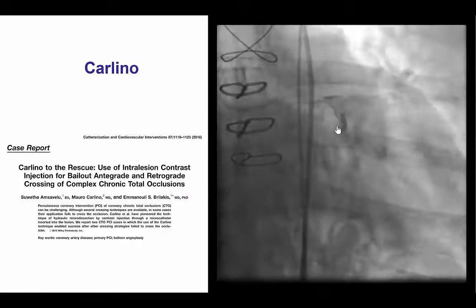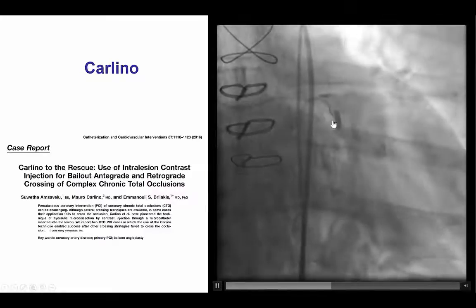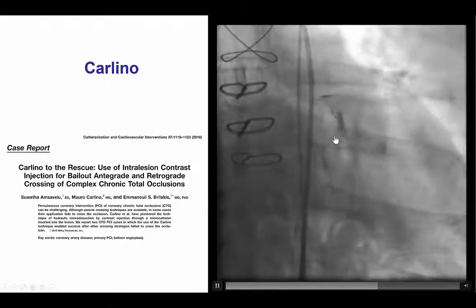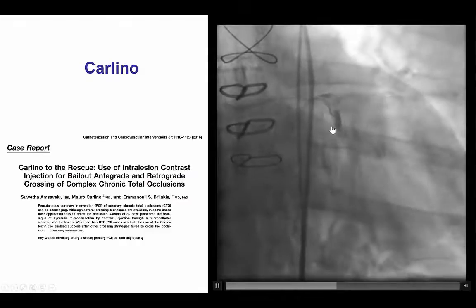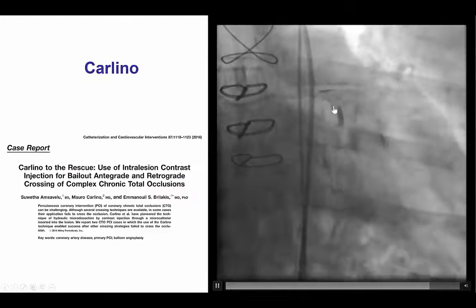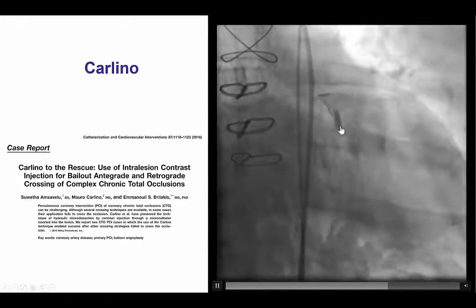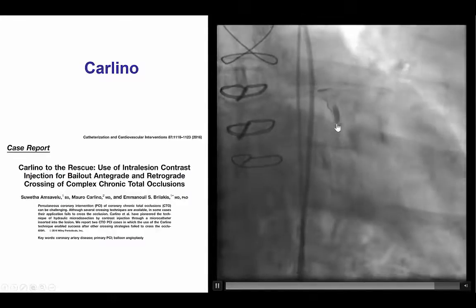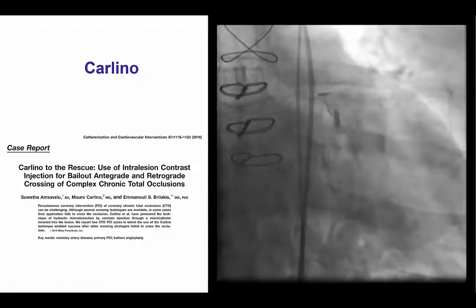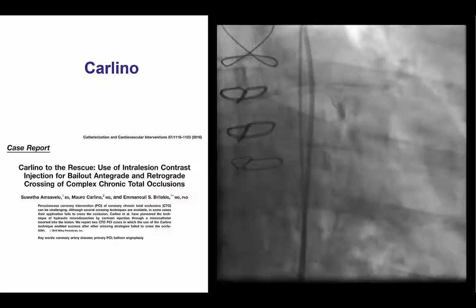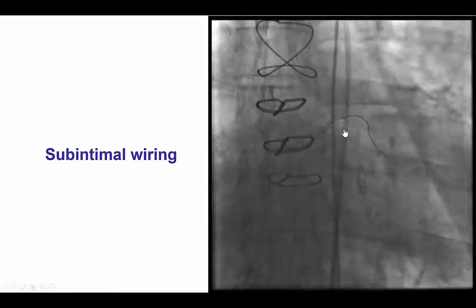That is why we switched to the Carlino technique. We injected a small amount of contrast through the Venture catheter into the proximal circumflex, seeing a subintimal stain and some contrast coming back all the way into the left main. This technique can be very useful when things get stuck or no guide wire can advance, as the contrast injection may help open some microchannels and facilitate subsequent wiring.